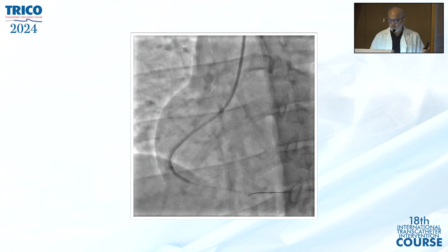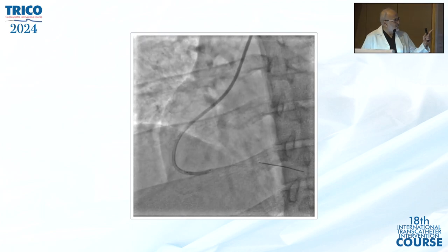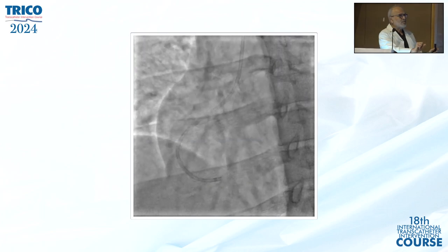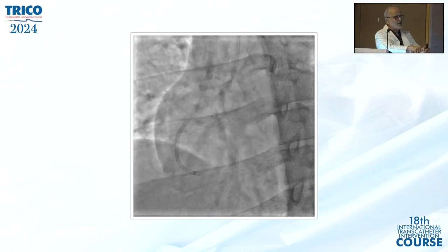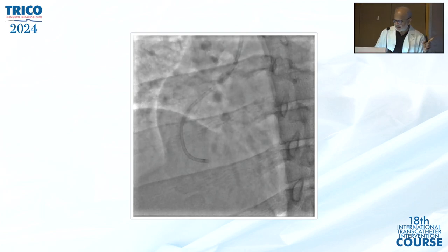Now, coming to the point, this was balloon assisted tracking in coronary, the modification. We went up to the bifurcation, then you remove everything, attach a 50cc syringe to the guide, very carefully with counterclockwise rotation and complete negative suction on the 50cc syringe.